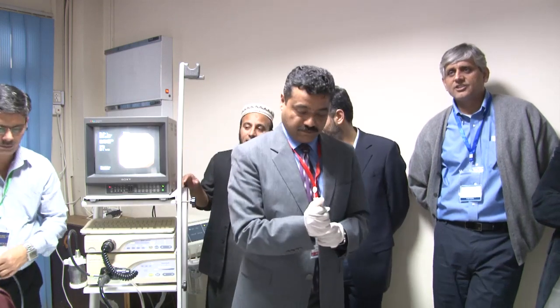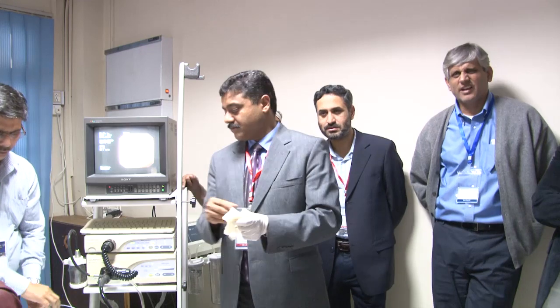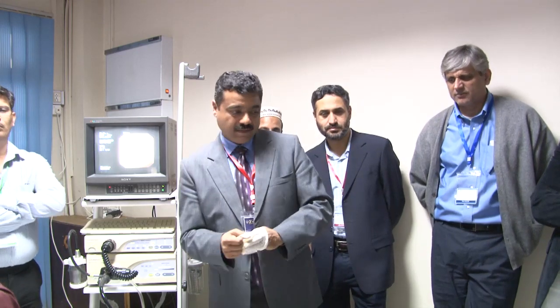Whoever is next. सबका हो गया. You put stents. बेटा उससे बोलो stents ले आए. हाँ बेटा और. Stent insertion set के साथ stent ले आए कोई एक size. 10-7, 10-5 doesn't matter.